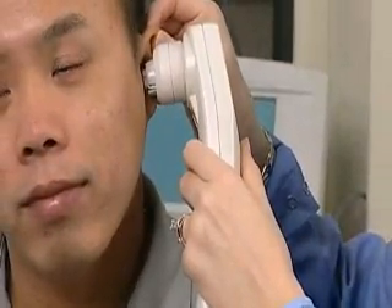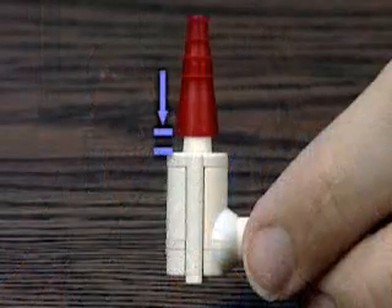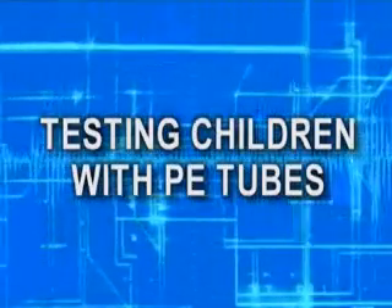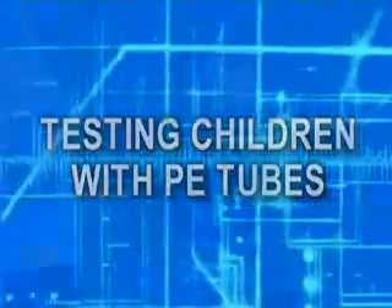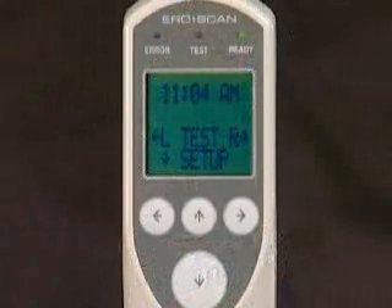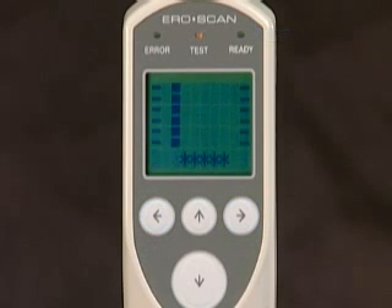Testing with the internal probe is similar to that of the external probe. Select an eartip appropriate for the patient, keeping in mind that the deeper the seal, the larger the emission — therefore, selection of a smaller eartip is generally preferable. Make sure the eartip is fully seated on the probe. The Ero-Scan can also be used to test children with PE or pressure equalization tubes. Insert the probe into the ear canal and obtain a proper seal. Then disable the auto start by pressing and holding the appropriate arrow key until the green test light turns off. The Ero-Scan will now calibrate and test the PE ear, and standard pass/refer results will be displayed.